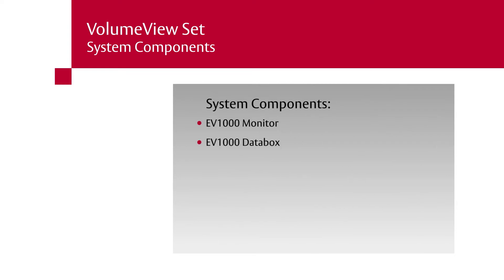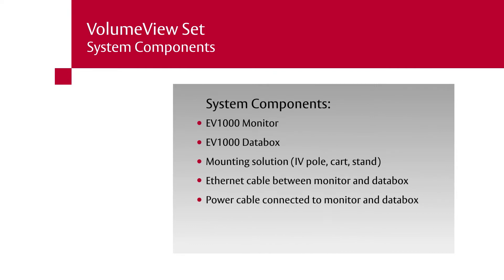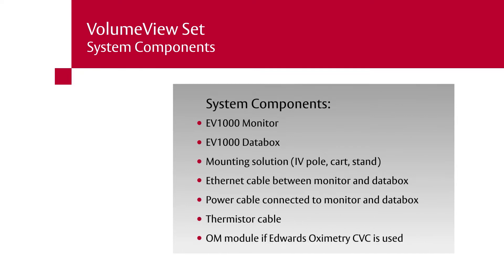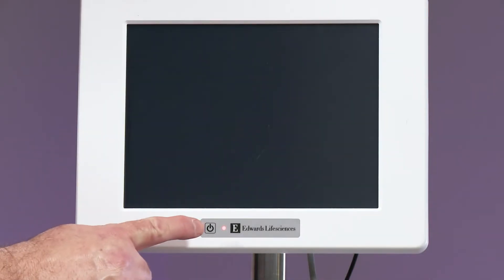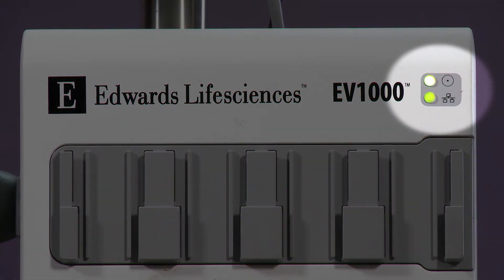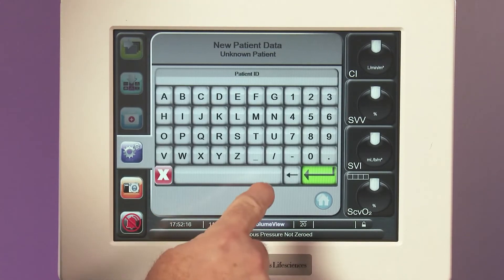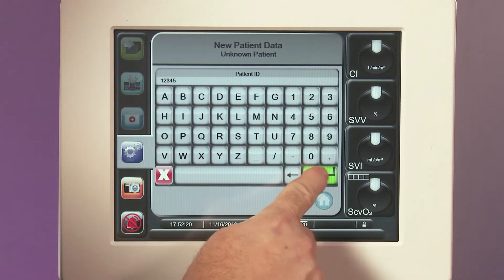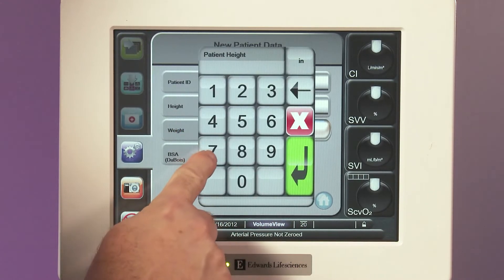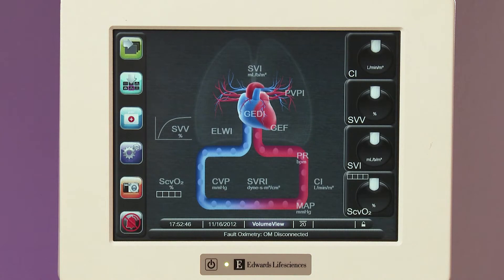Confirm the presence of: monitor, data box, mounting solution, Ethernet cable between monitor and data box, power cable connected to monitor and data box, thermistor cable, and optical module if the Edwards oximetry central venous catheter is being used. Turn on the EV1000 clinical platform by pressing the power button on the front of the monitor. Confirm that the data box LED lights are illuminated green. After the startup screen, enter the patient's ID number as well as their biometric data: height, weight, age, and gender. You are now ready to set up and prime the volume view sensor and TrueWave transducer.